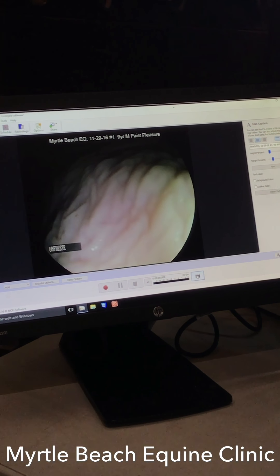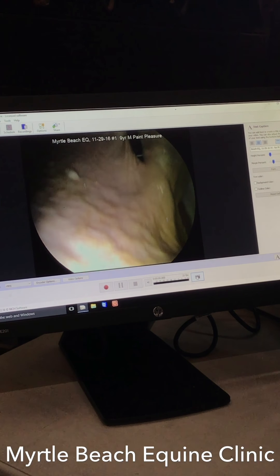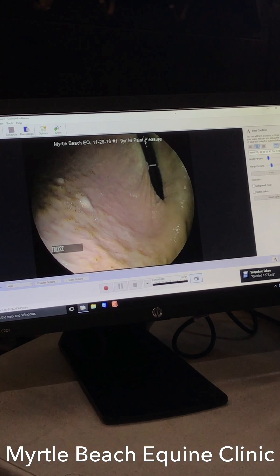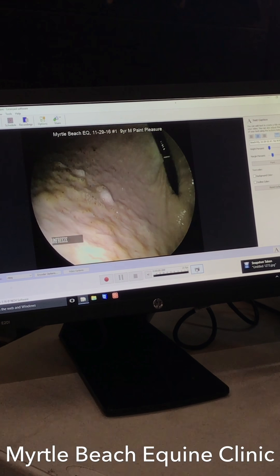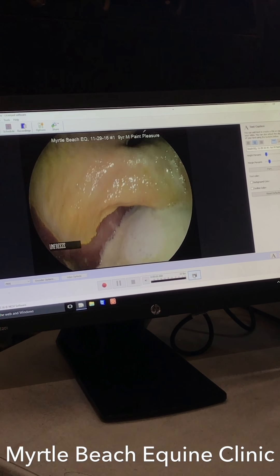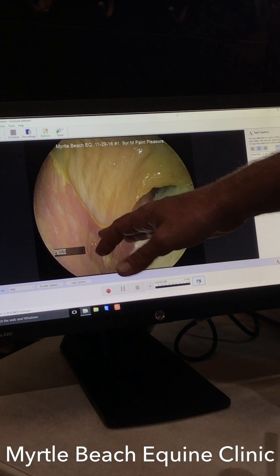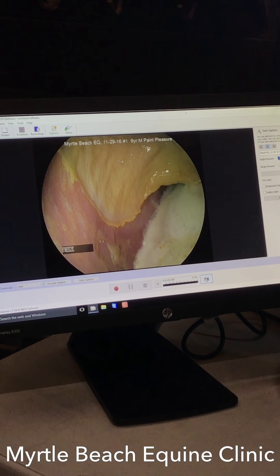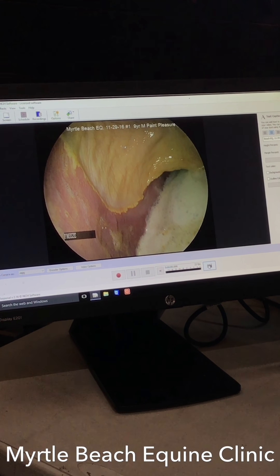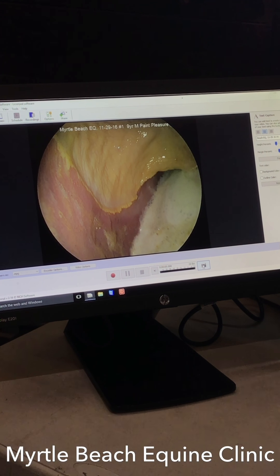Historically the original ulcer studies were looking at the top part of the stomach, and that had a lot to do with the equipment at the time. They had more human-type systems — more rigid fiber scopes — and that was the area we could see. We didn't get down toward the pylorus like we do nowadays. There's actually a lot of research going into looking at the lower part of the stomach because the ulcers don't look the same there and don't behave the same. This is nice and clean right here on what we call the margo plicatus. This dividing line here between the two — the margo plicatus — is always an area where you can find ulcers and irregularity, because that's the lowest part that's normally bathed in acid all the time, so it has the most exposure.